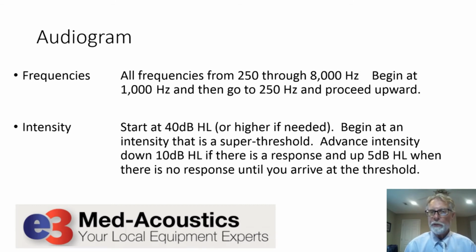All right, so we would begin at a suprathreshold level. 40 dB is typical, okay? But if they don't hear it at 40 dB, then we would apply the stimulus with the interrupter button at a higher level.